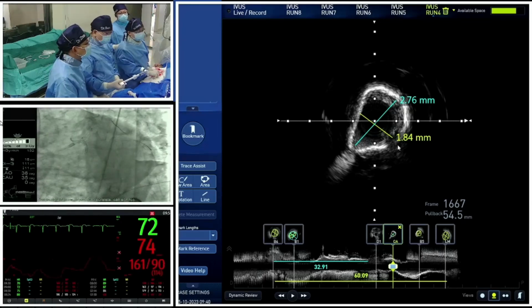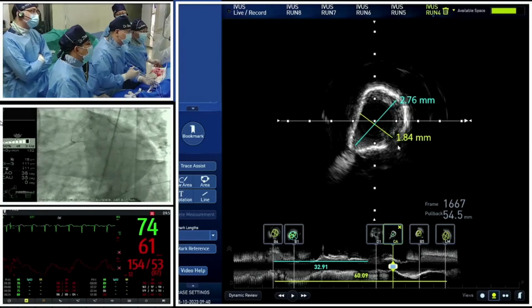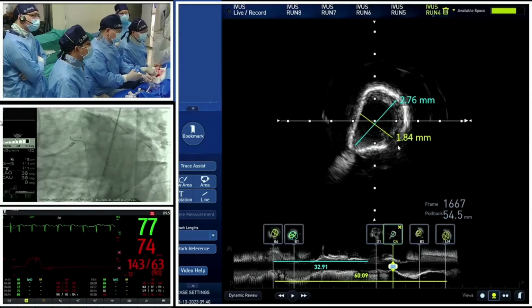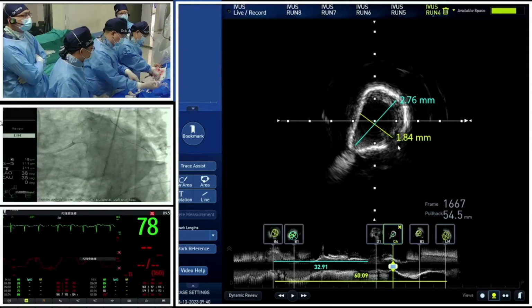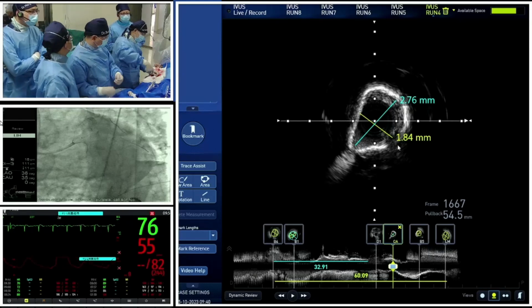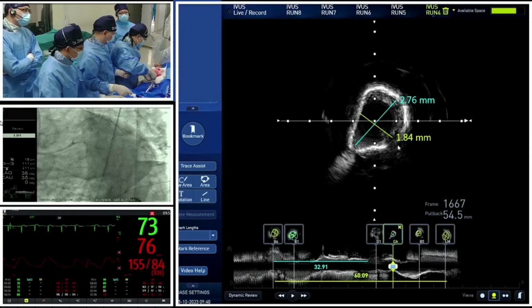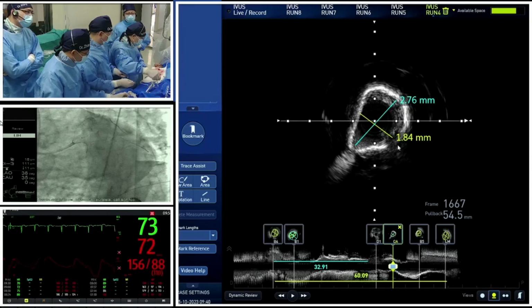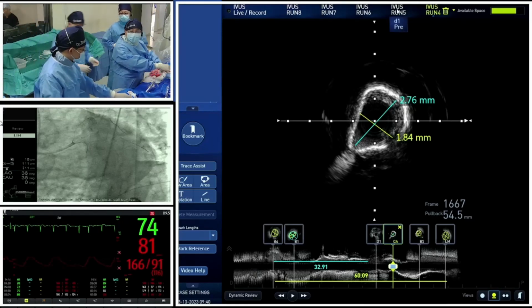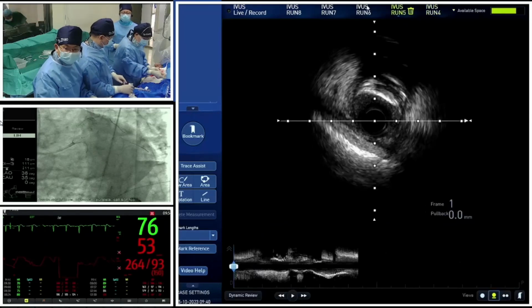We could say the most severe calcification is located in the proximal part of LAD, because the lumen, I think, is kind of big enough. That's why Dr. Gong chose IVL to pre-treat this calcified lesion. So I think we used maybe 6 or 7 cycles of pulses. And then after that, we also performed the IVUS. So could you show us the IVUS after the use of IVL?